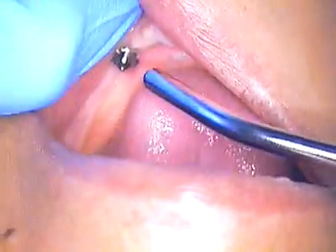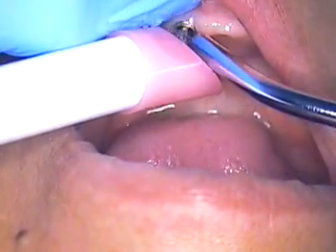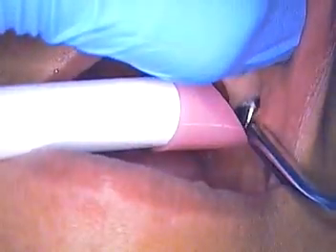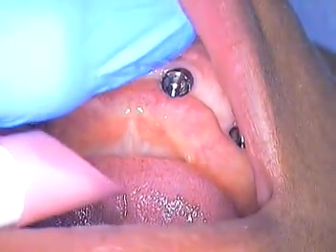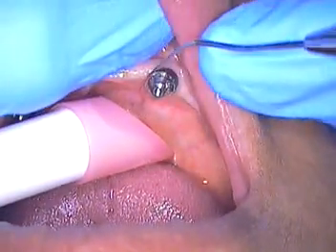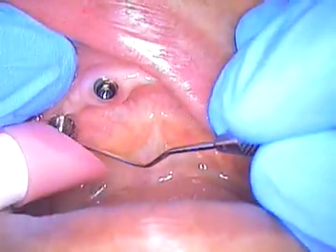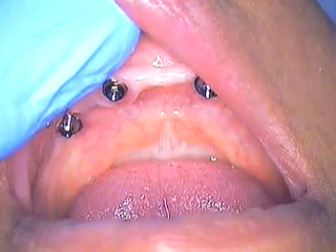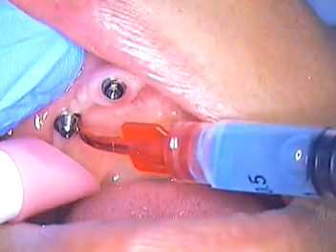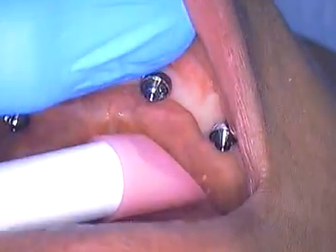And first thing I'm going to do is wash everything off. Alright, get everything cleaned thoroughly. You okay? I'm going to start on the left side. And just going to make sure that there's no tartar built anywhere, or any food debris. Okay, I'll use some cavity cleanser. Alright, and we'll rinse that off.